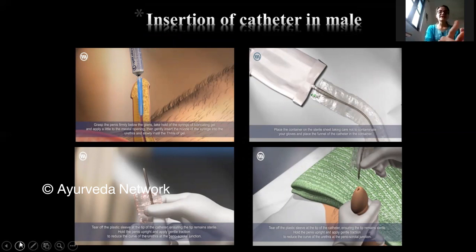Okay, now I think it is not there in this slide, but one slide is missing. Before you do all these things, the very first thing you should do is to clean the entire area around the penis. You take a gauze piece, dip it into the betadine solution, hold it with the forceps, and clean the entire area. Before you even put this anesthetic jelly, you have to clean the entire area.